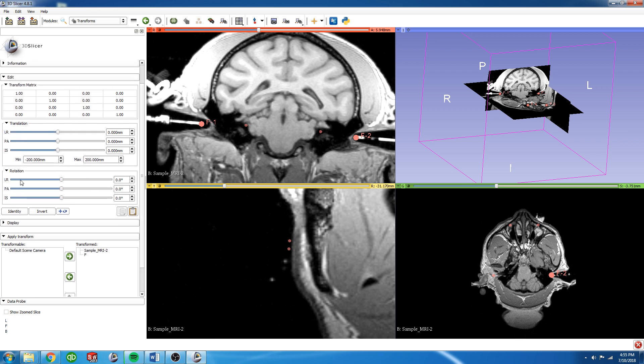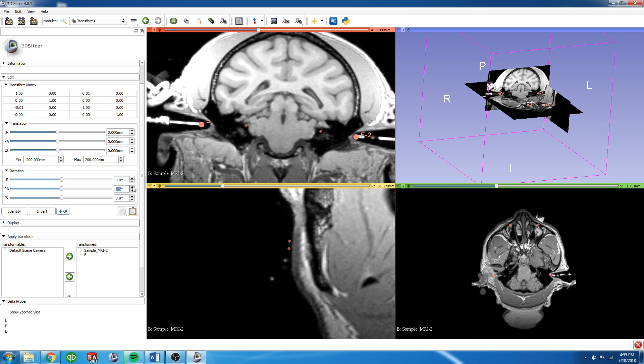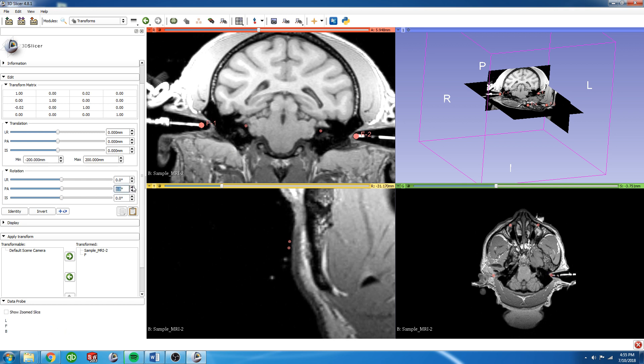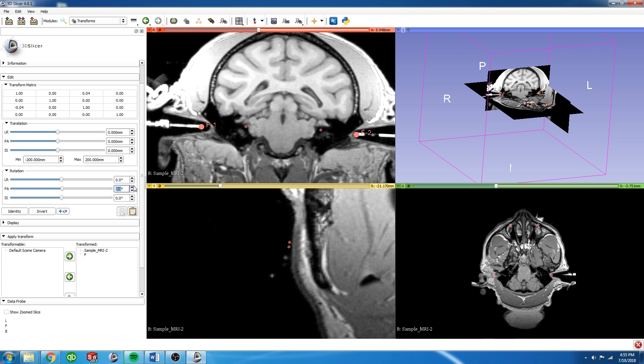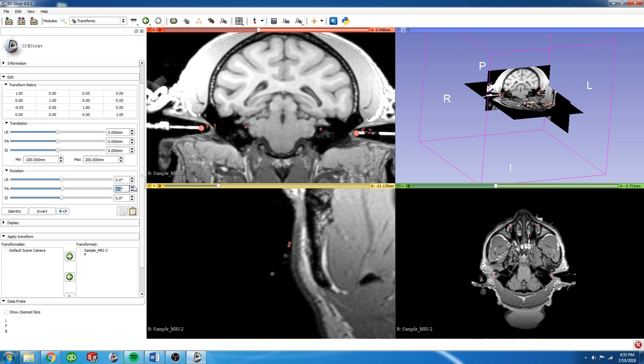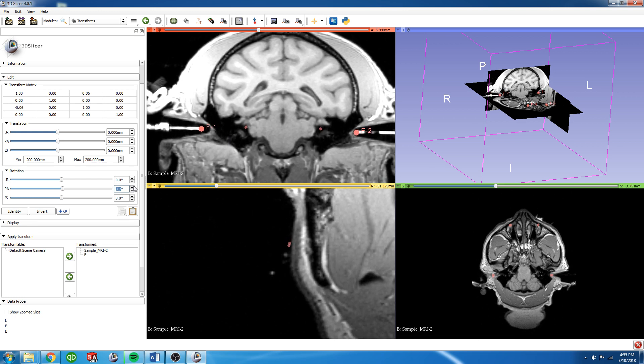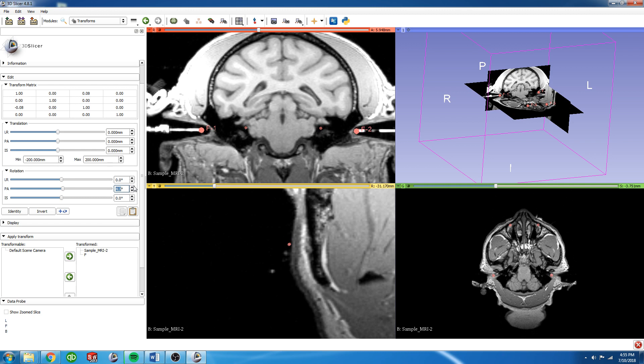We're going to be adjusting these rotations. So for this example we're going to rotate it this direction until we get those pretty straight. We're going to say about 5 degrees is good.